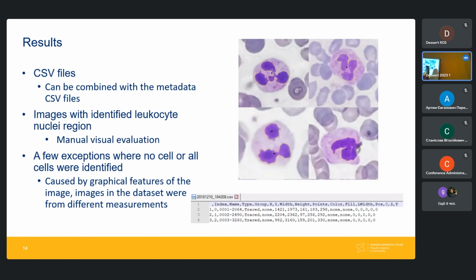What decides when to stop the dilating? Well, that's up to the user. You can move 1 pixel or a very little amount, and you can do the operation once or 10 times. So you decide that at the beginning and then let it go. Exactly.